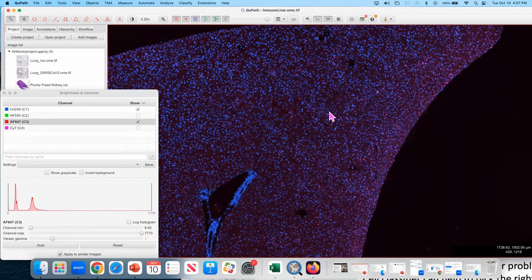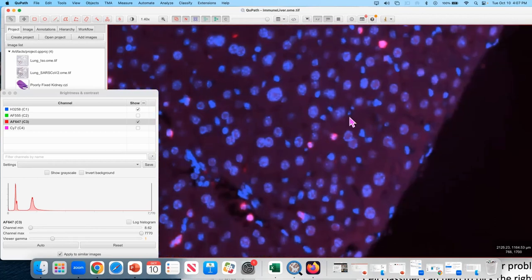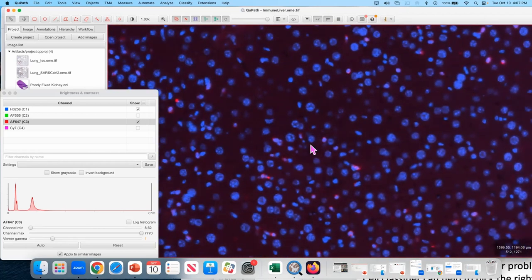I've heard a rumor that someone thinks it might be a classifier. That's one way to do that. The other way to do that is to incorporate the information about the background around these cells, because that background here is greater than the background over here.